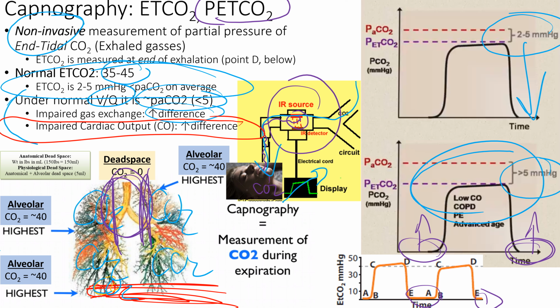Okay, so capnography is the measurement of CO2 at the end of expiration, so they exhale completely. Sorry, so then the waveform would be starting at like 10 or 20. Yeah, it'll start going up. You'll see it go 5, 10, 15. It'll start going up a little bit. The baseline. The baseline. Gotcha.